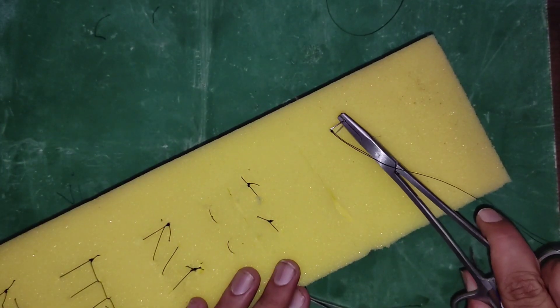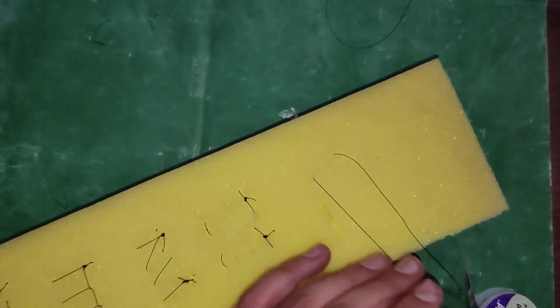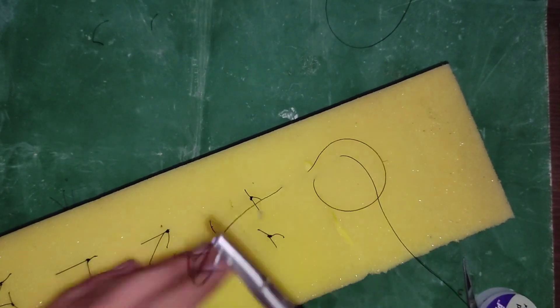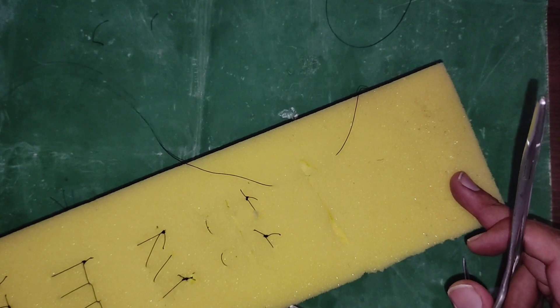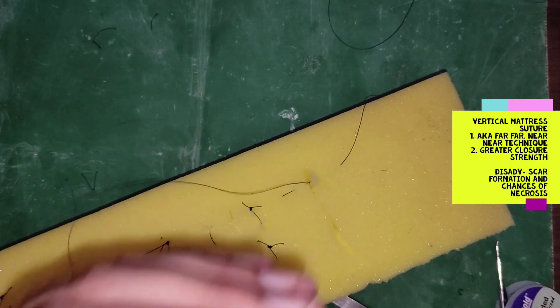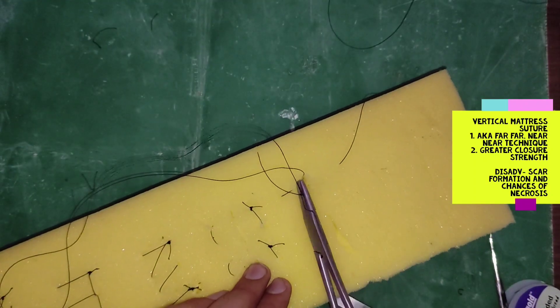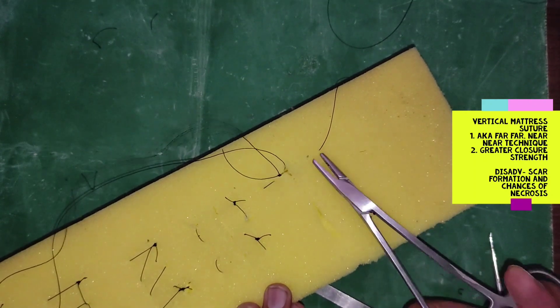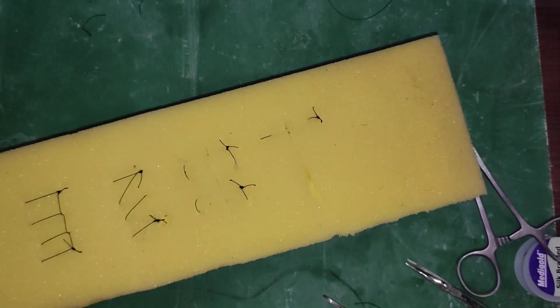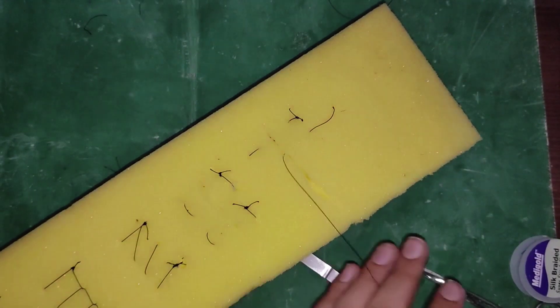The fifth suturing technique is vertical mattress suturing. After completion of the first step, you have to re-attach the needle on the same side of the incision, so that you can easily complete the second step on the other side to form the vertical mattress configuration.